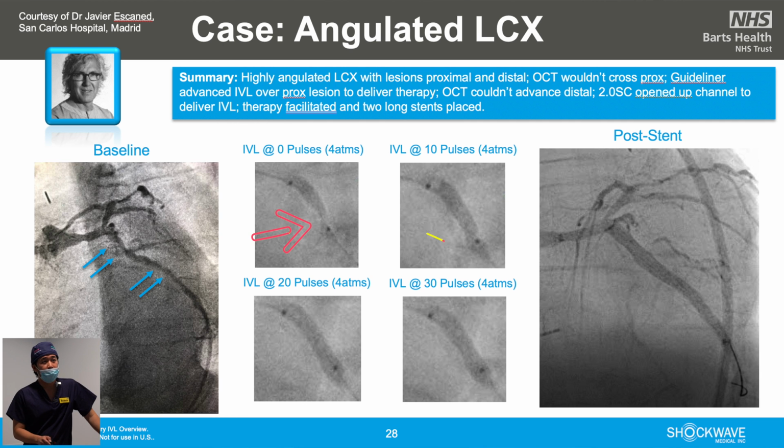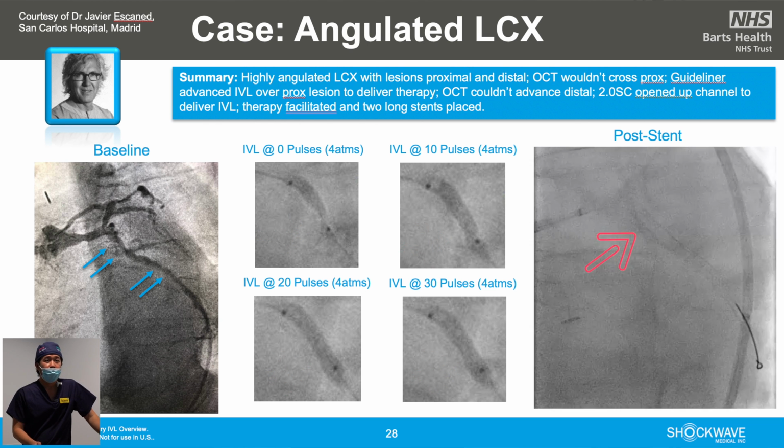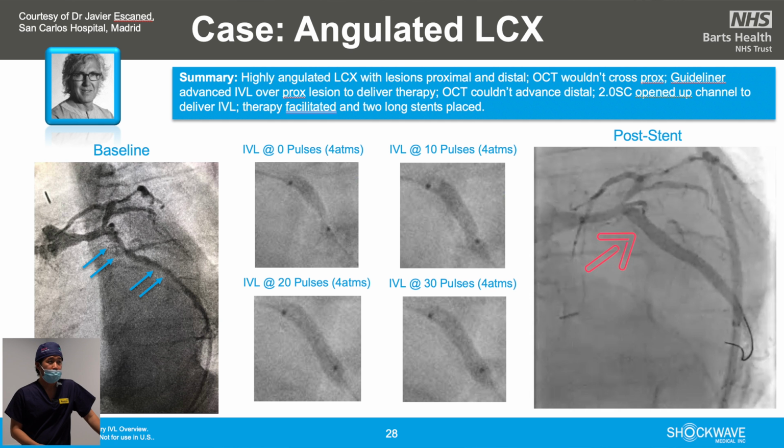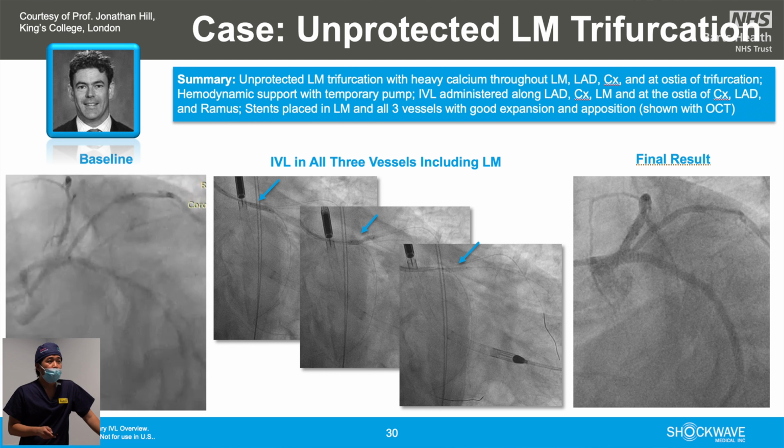Before Shockwave, you can see the balloon. There's a dent there, and after 10 pulses, it started to expand. Yeah. And this one, I remember this case. So we used 3 Shockwave balloons at the same time. This is a trifurcation lesion.